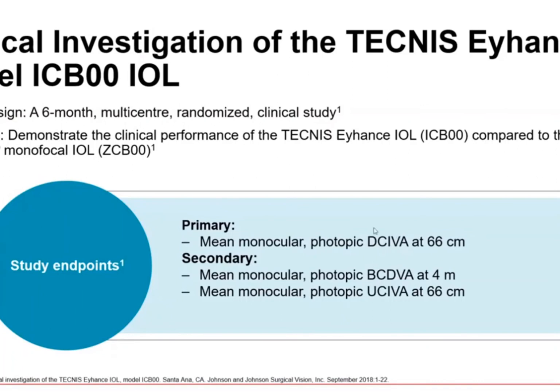So meaning that they have best corrected the distance to emmetropia before measuring the intermediate vision.